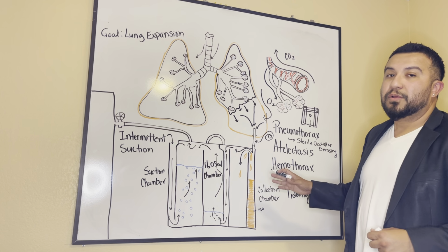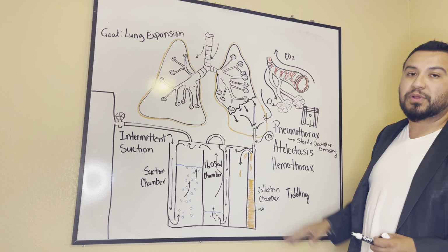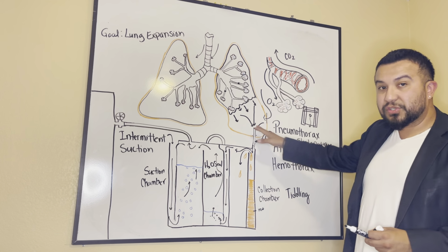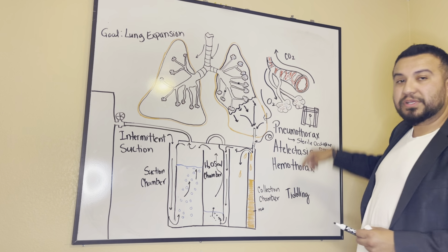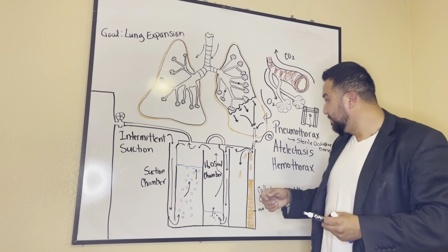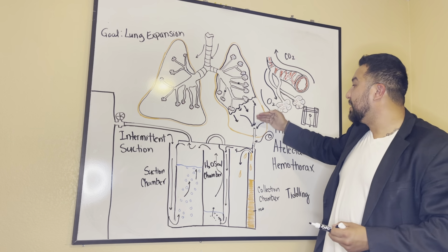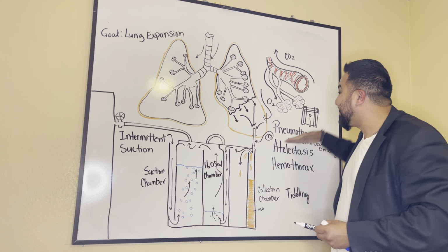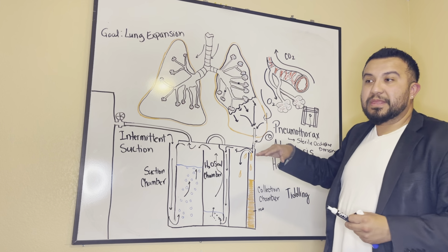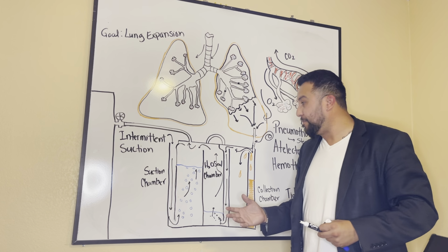At the bedside, we discussed the sterile occlusive dressing. You must have a sterile occlusive dressing at the bedside in preparation for this potential that the tubing may slip out of the patient's chest. And at that point, we cover it, we tape 3 sides, and we discuss the rest. At the same time, you want to have clamps at the bedside because if there is a leak, you want to clamp the tube proximal to the patient so none of that atmospheric air gets sucked inside the patient's lung, which is going to further collapse the lung, and the patient will have to start all over again in regards to the time spent on the chest tube drainage system.